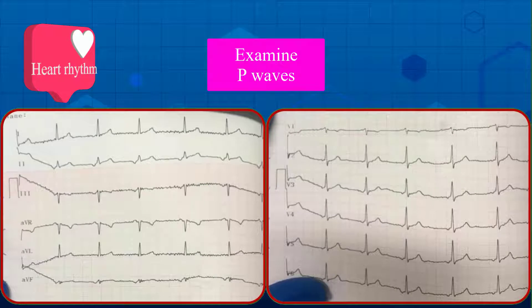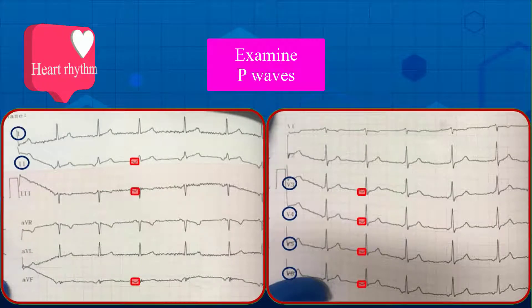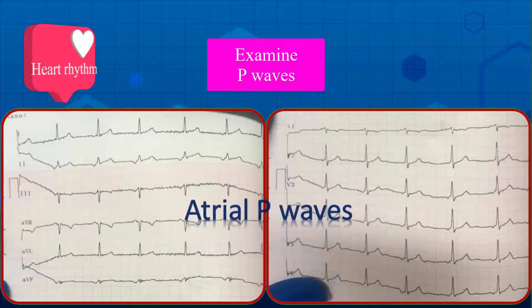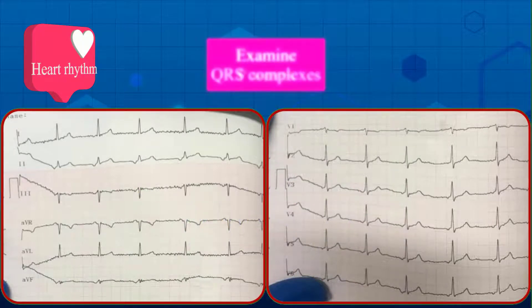One: locate and examine P wave morphology. We expect sinus P waves to be upright in D2, D1, and V3 to V6, but here the P waves are negative in D2, D3, AVF, V3 to V6, and upright in AVR. So the P waves are originating from the atria, not the sinus node.